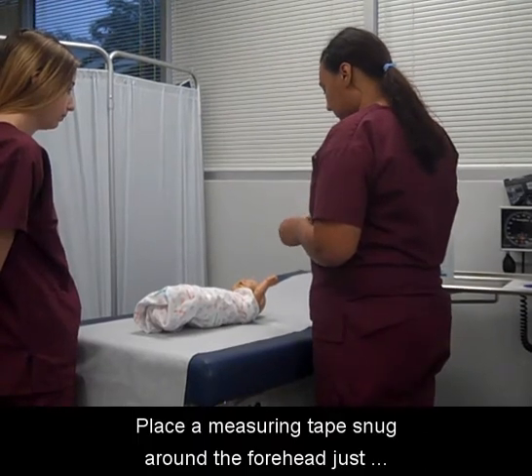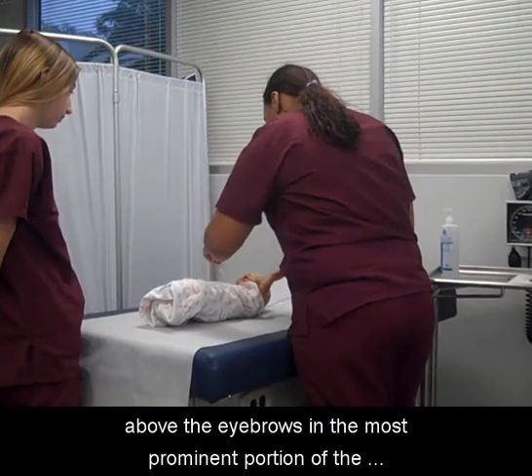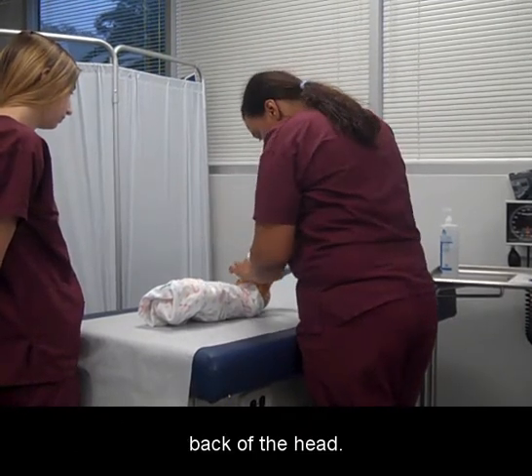Place a measuring tape snug around the forehead, just above the eyebrows and the most prominent portion of the back of the head.